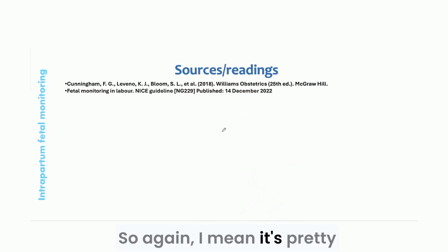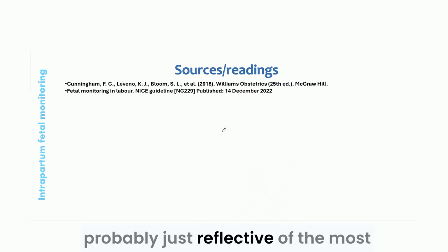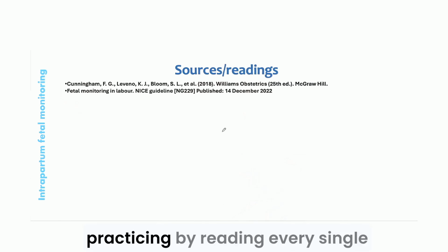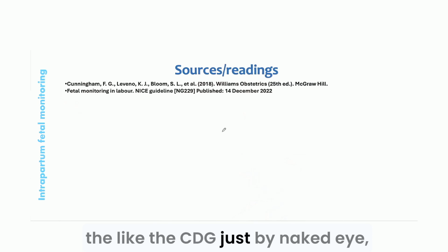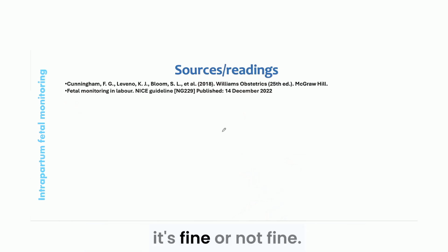So again, it's pretty detailed, and the last version has been recently updated, so it's probably reflective of the most recent evidence. And that's why I really recommend using this system to read the CTG. It's always good to keep practicing by reading every single CTG that you see, and avoid judging the CTG just by naked eye, just saying that's okay or not. Try to always categorize your CTG and justify why you think it's fine or not fine.